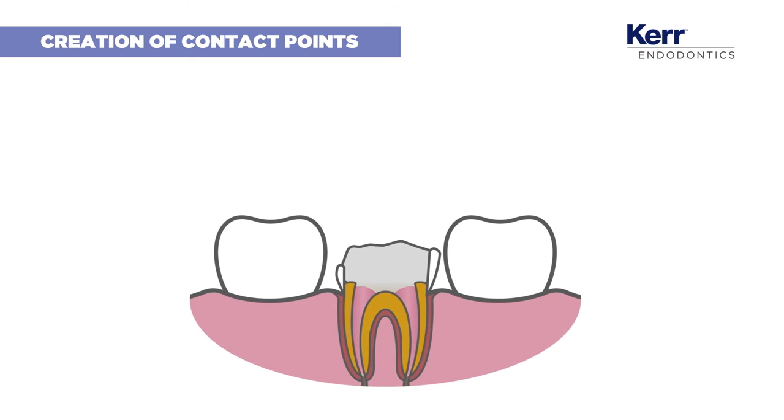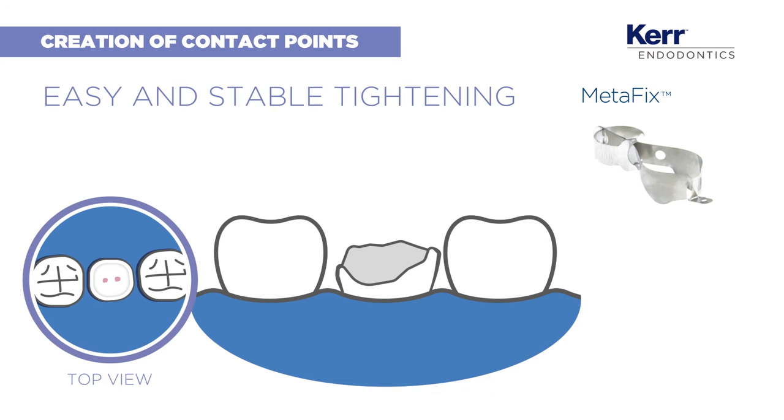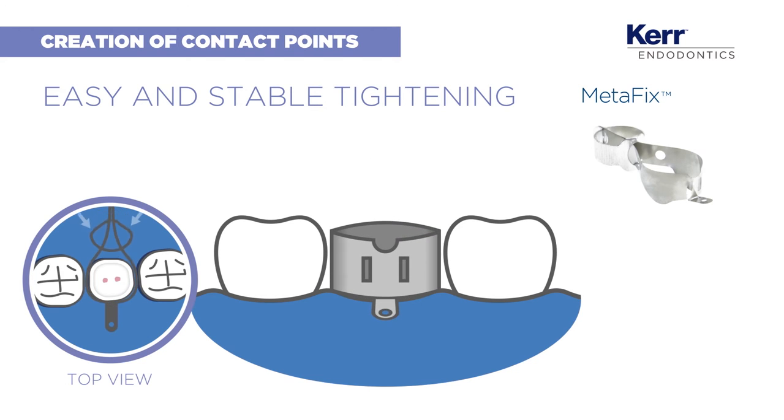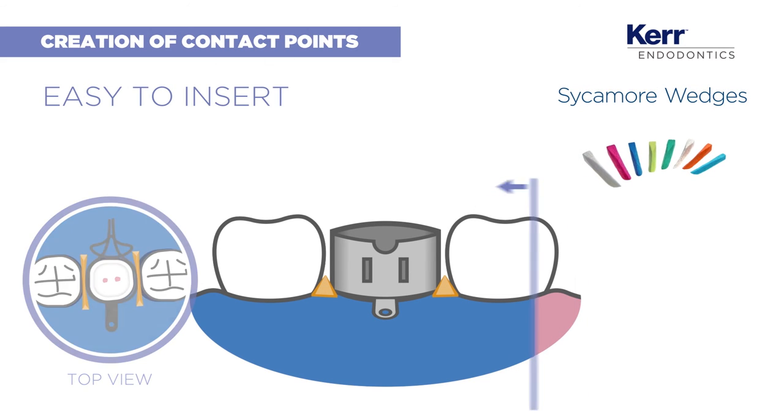We're ready to build the tooth. Let's start by creating some contact points to help define the contour. Metafix is an all-in-one matrix system, so easy you can clamp and tighten it in a blink, release it in a wink. Now place the wooden wedges to stabilise the matrix.